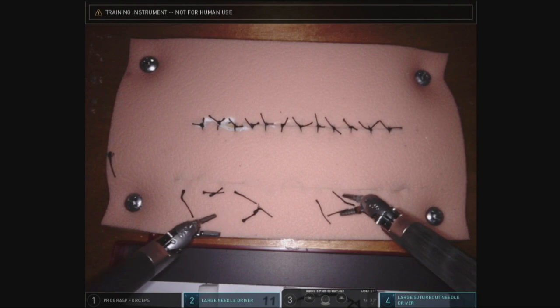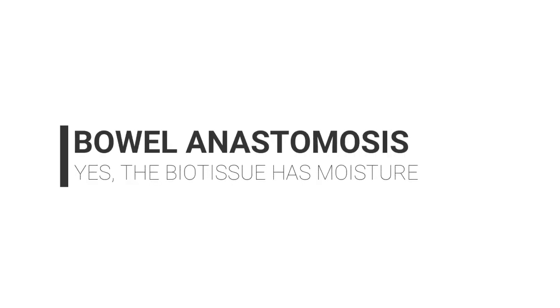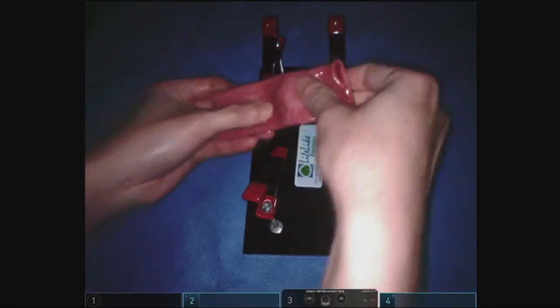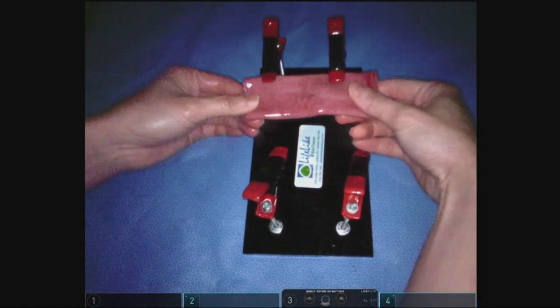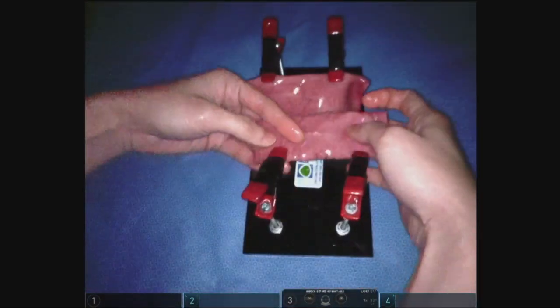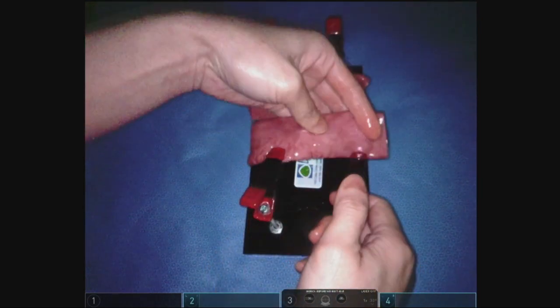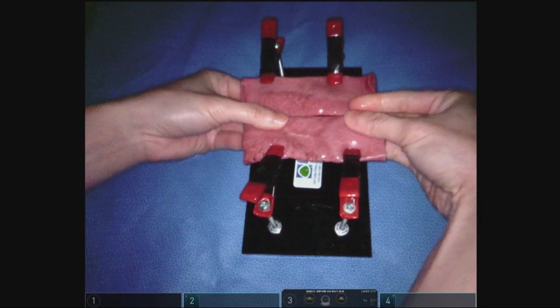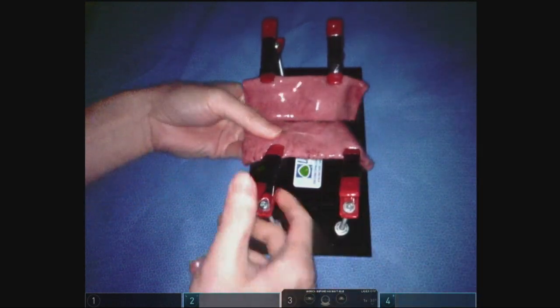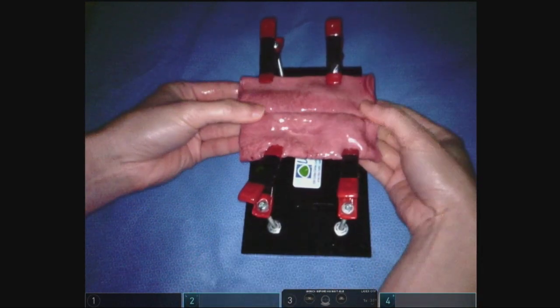Next is the bowel anastomosis exercise. The biotissue in your Ziploc bag has some moisture in it, so don't be too surprised. Clip one end to the stand and then the other bowel to the opposite side. You have to make sure that they meet in the middle without much tension. If not, your anastomosis will leak because it has to be tension-free.